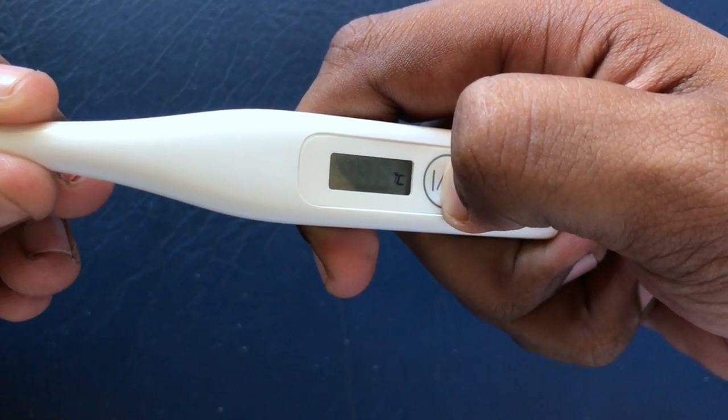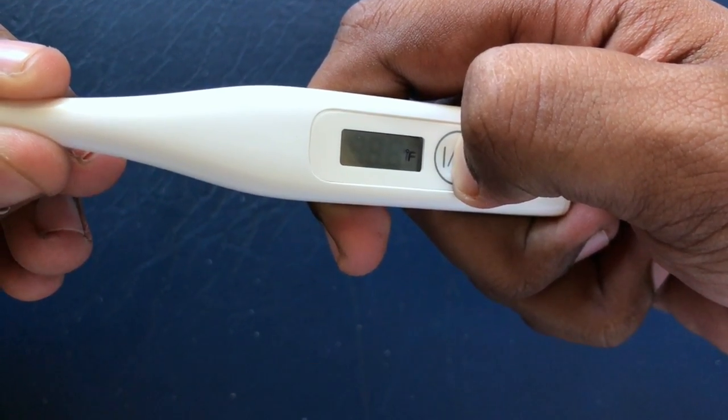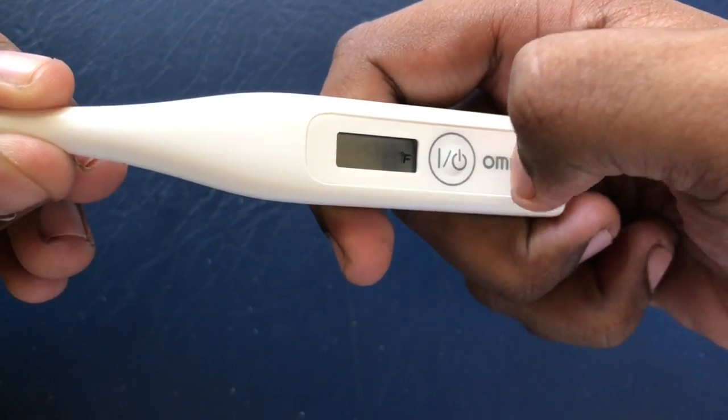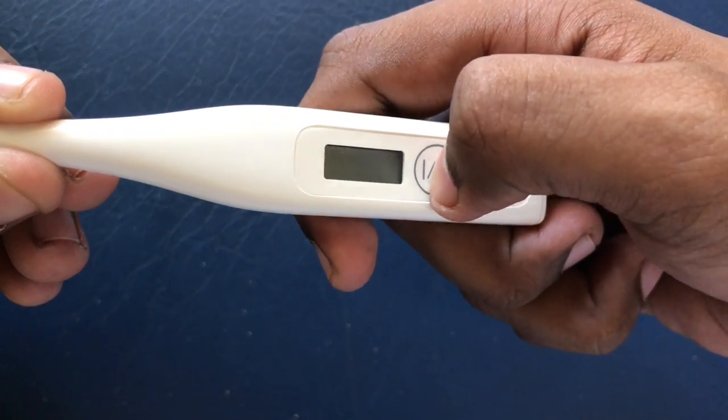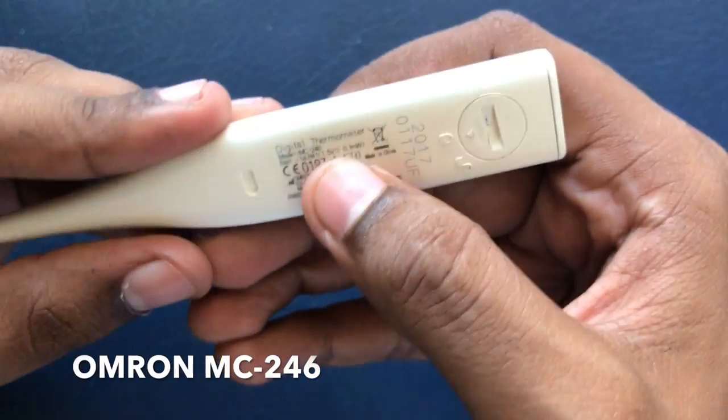Hello everyone, in this video we will be showing you how to switch from Celsius to Fahrenheit or vice versa in a digital thermometer. In this video we will be using an Omron MC246 thermometer.